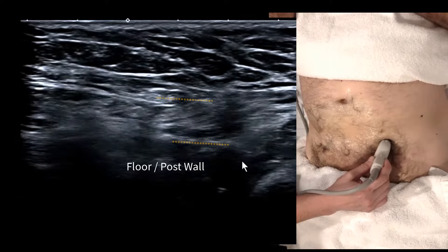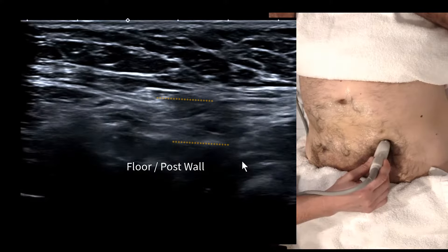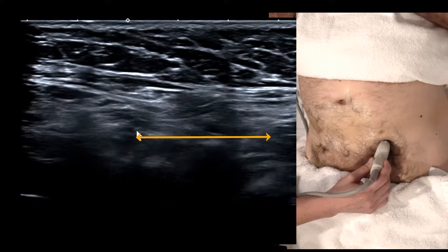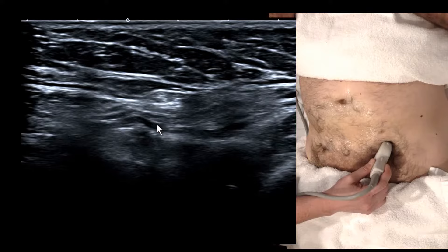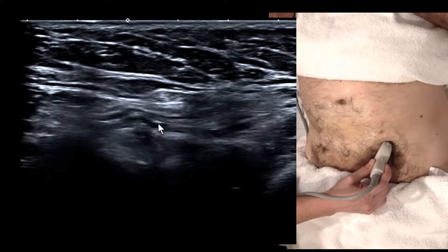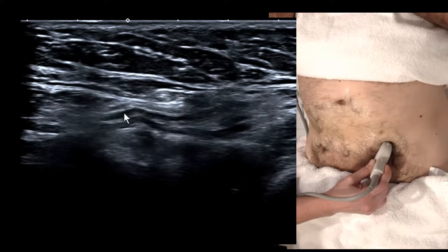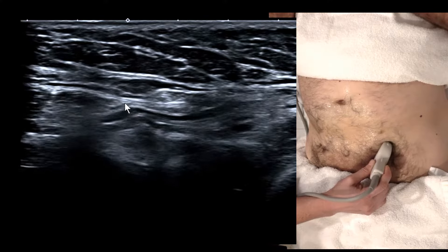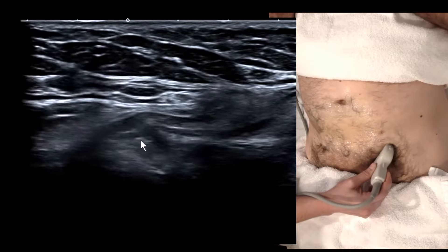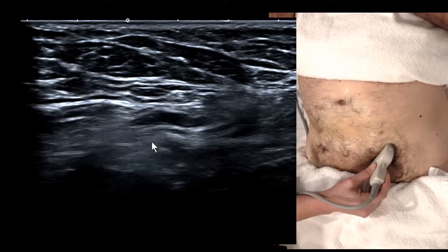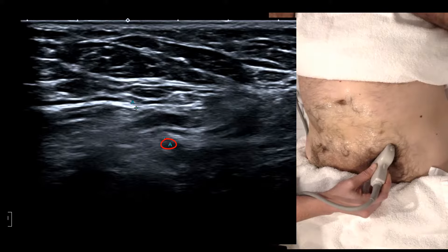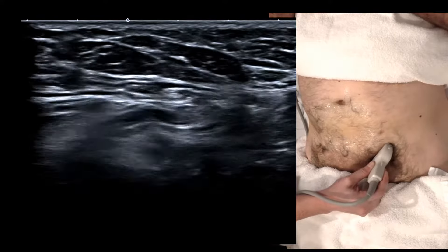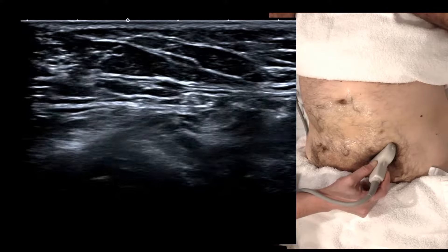The entire canal is only the length of your transducer footprint — just three to five centimeters. As you follow those veins, you can see at a certain point instead of traveling horizontally they drop in slightly. That angulation gives away the deep ring, which is the entrance to the inguinal canal. From the inferior epigastric artery over to here is the deep ring, and in most men that should be below 10 millimeters.